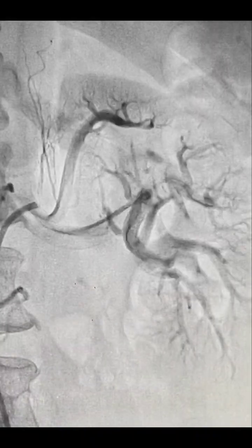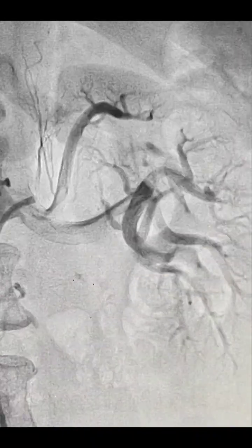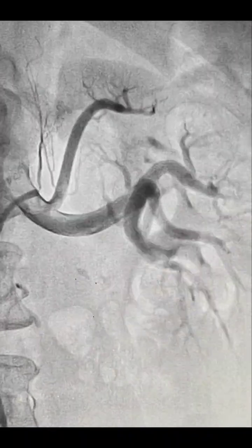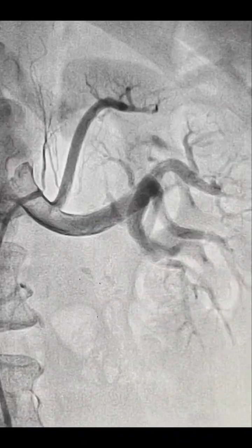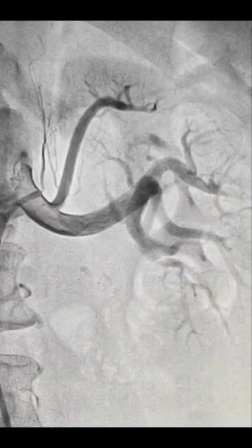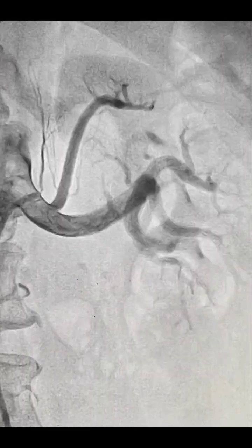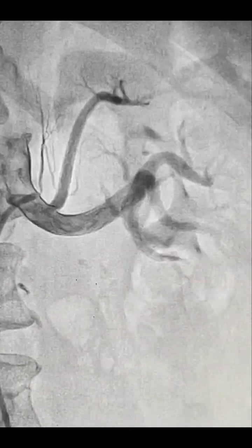As the patient was in hypotension and there was a very feeble pulse in the radial, we tried for the radial, but there was no access through the radial artery, so we had to go with the femoral. Whenever we do femoral, we take one shot of the renal, as the patient is a diabetic and a chronic smoker. So this is a left renal artery.